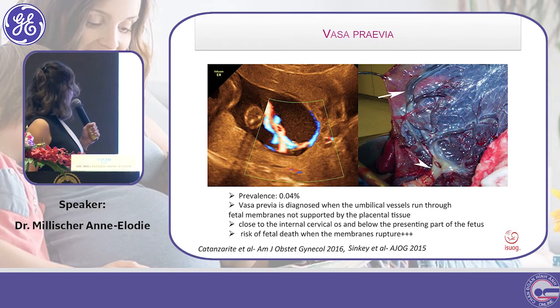Và cái mạch máu tiền đạo là một cái đặc điểm rất là quan trọng khi mà các bạn thấy có một cái nhau bám thấp, cho nên khi mà các bạn khảo sát tử cung thì các bạn nên bỏ Doppler vô để các bạn chắc rằng nó không có một cái mạch máu nào bám ngang qua cái lỗ trong cổ tử cung.